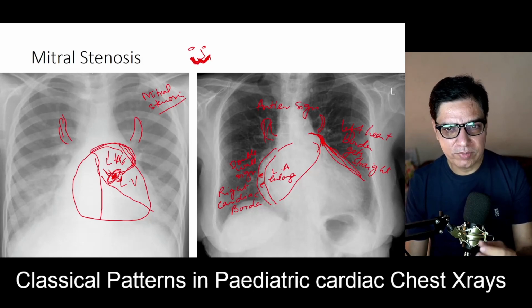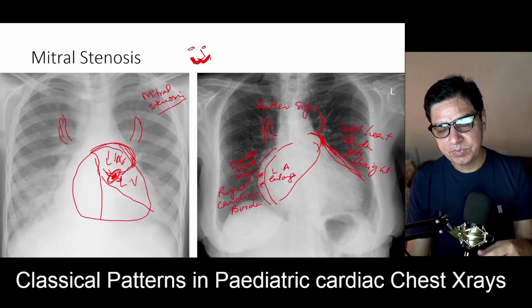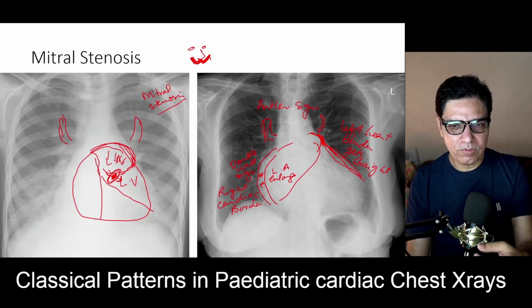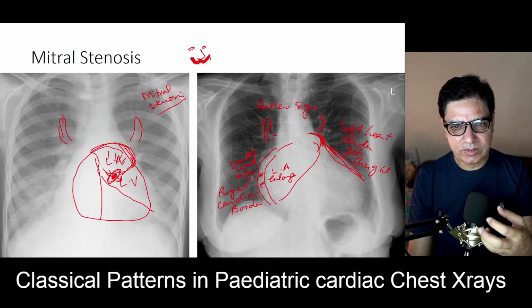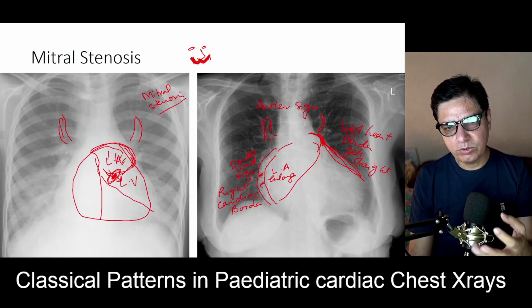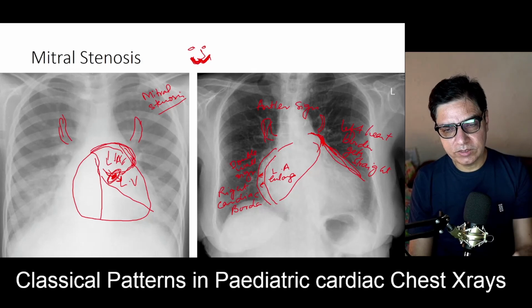So I hope you have liked this. I have tried to simplify it with some form of memory aids, by which it is easy to refer to these signs and understand what could be the reasons or causes of these signs.